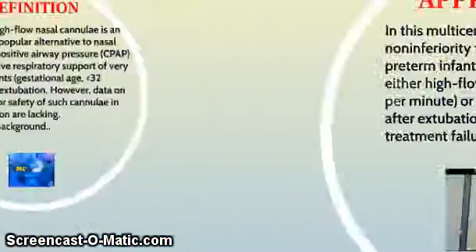We use the oxygen blender to control the oxygen concentration from the gas sources. We immerse the distal tubing into the water to control the CPAP pressure, and we connect the CPAP circuit to the patient with a Hudson nasal prong CPAP. Anytime during the webcast, viewers can submit questions to the panel.